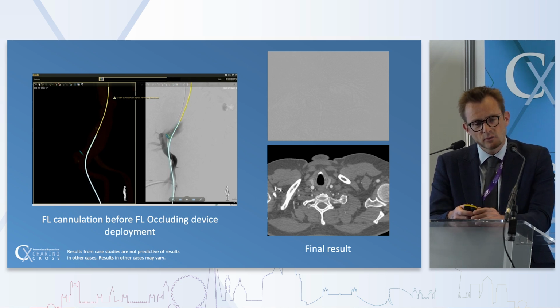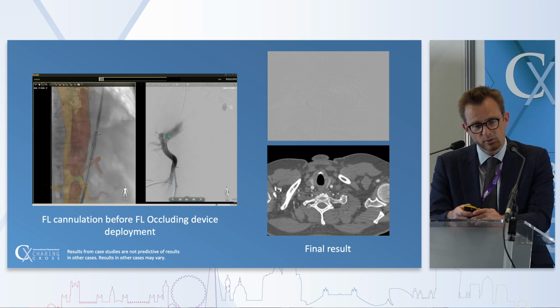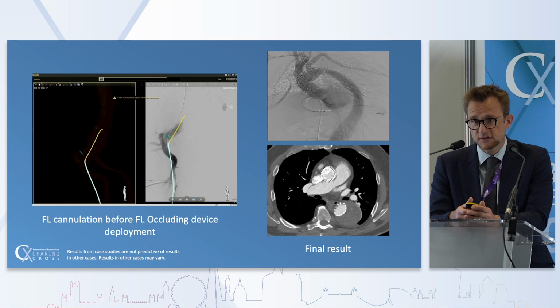And at the end, we went back to the false lumen until the aortic isthmus, and then deployed the occluding device. And this is the final result, which was quite satisfactory, with no clinical events after the procedure.